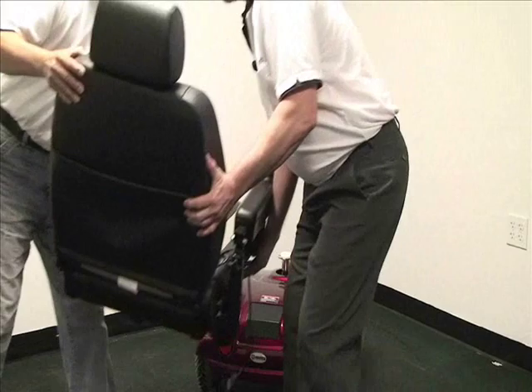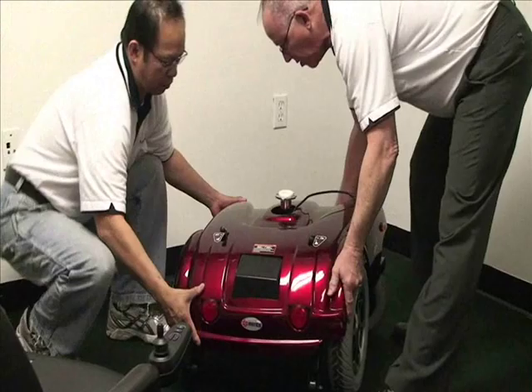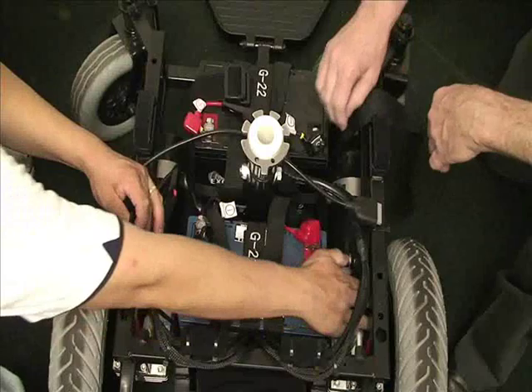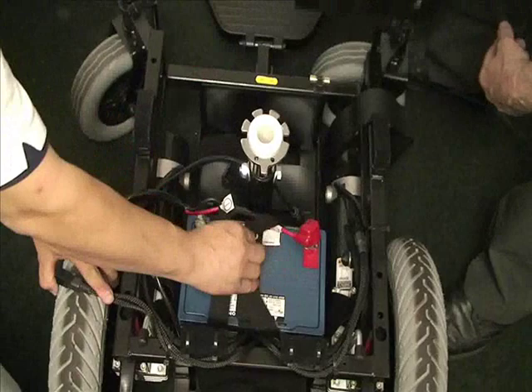The shroud is held down by Velcro. All you need to do is pull straight up on it and it'll come off. To remove the batteries, simply pull up on the Velcro straps, disconnect the connectors, and lift the batteries straight out of the frame.